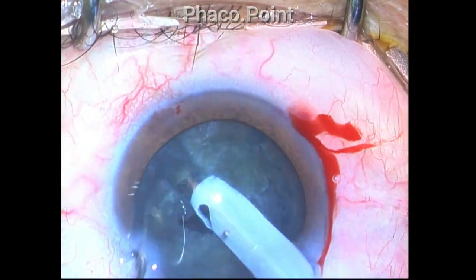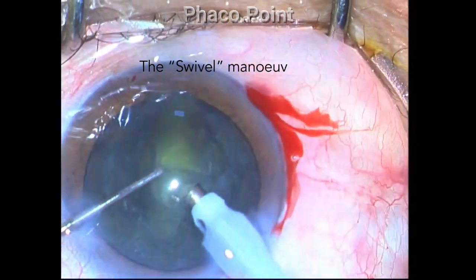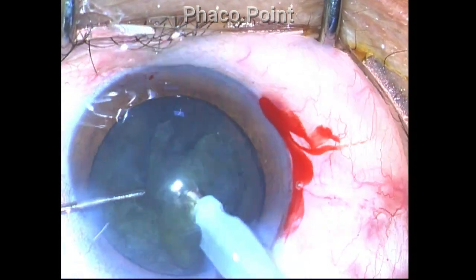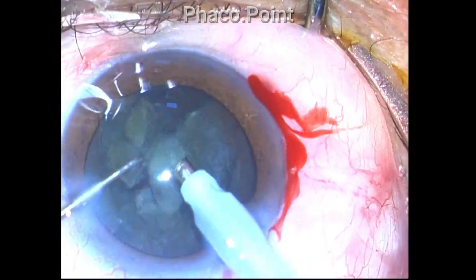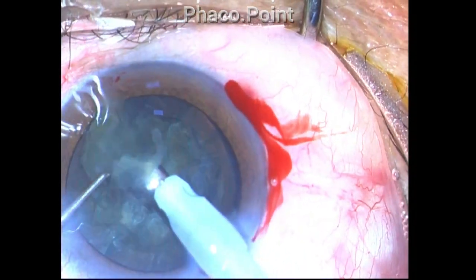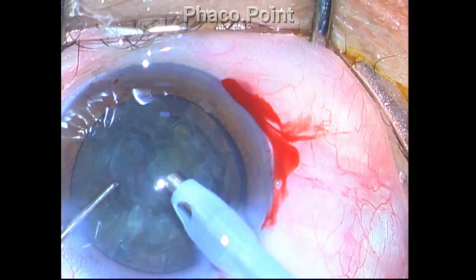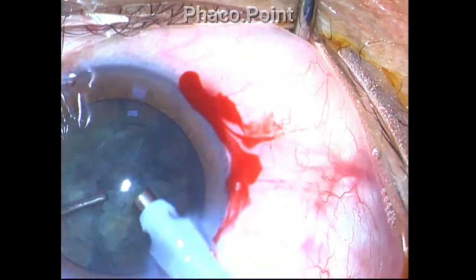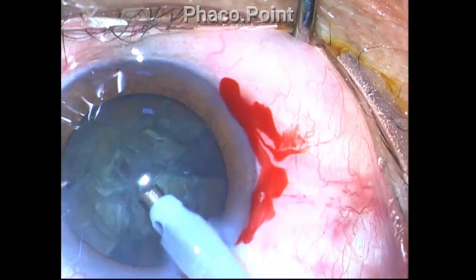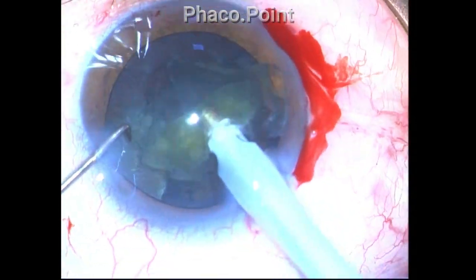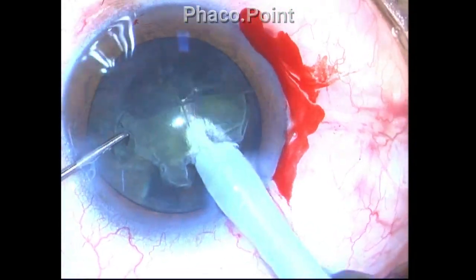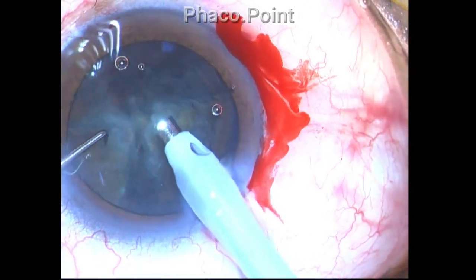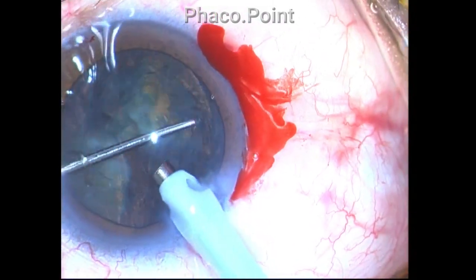Once you crack the piece and you have the fragment, hold the phaco tip steady in the center of the eye. If things are happening well, you don't have to swivel. But if there is a momentary drop in followability, gently swivel the phaco tip by 5 to 10 degrees on either side. You hold the piece and then gently swivel — and you can see that I am gently swiveling it around 5 to 10 degrees, and immediately the followability dramatically increases.